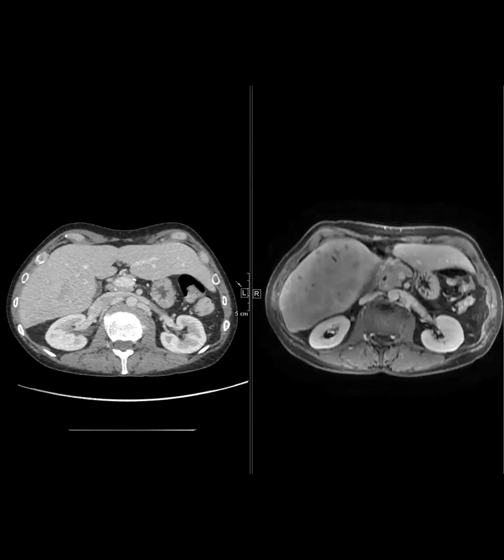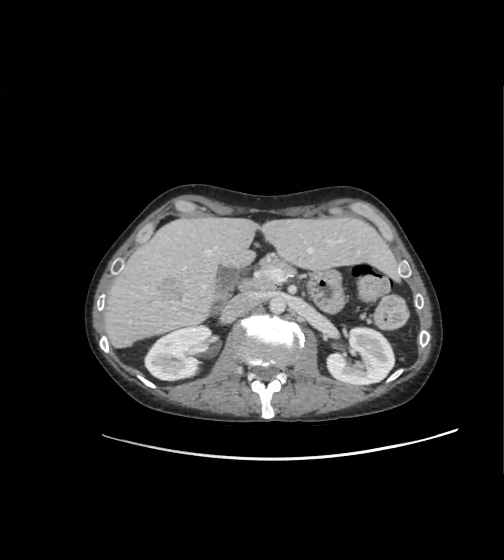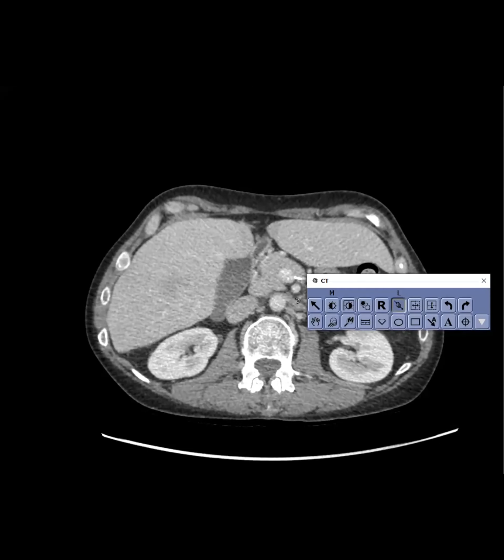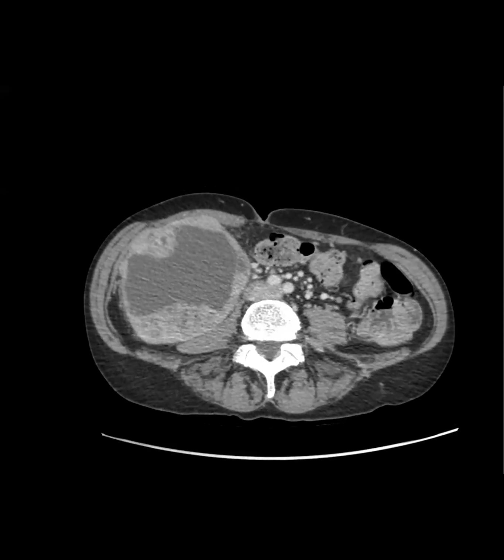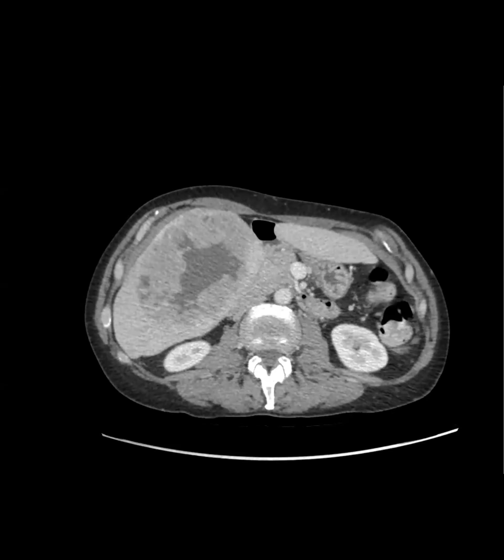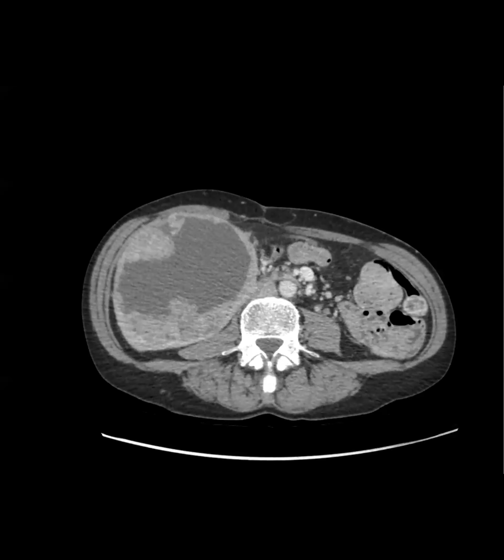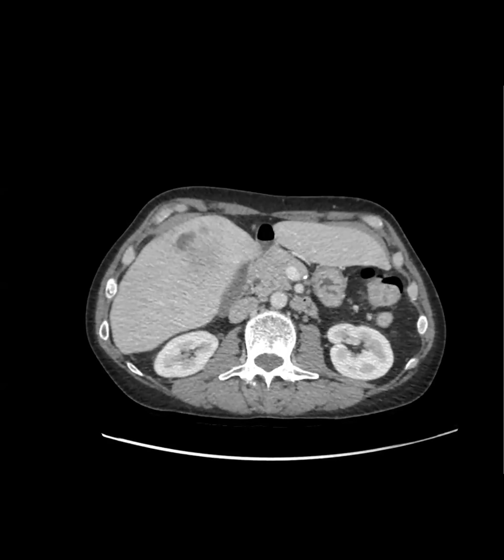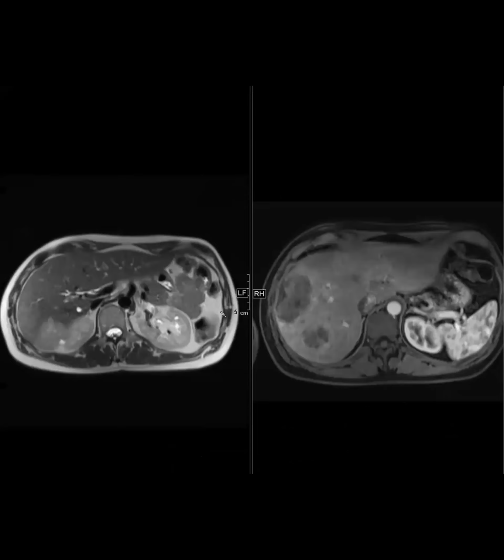This is a companion case of a patient who had a distal pancreatectomy, also for an acinar cell. I don't have the original imaging because it was done somewhere else. And then later presented with this liver lesion. You can see it looks a lot like the other person's tumor, where it's solid on the outside, hemorrhagic on the inside. So this was her liver met from acinar cell. And then this is a third patient with acinar cell.